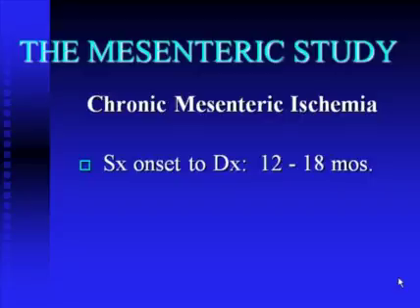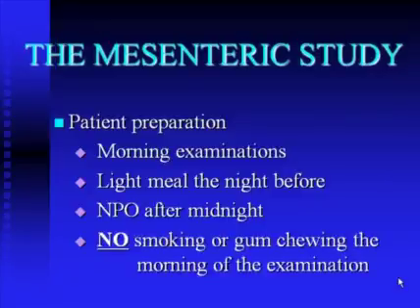I would hope through this talk to encourage the awareness of the hemodynamic factors involved with this and urge an early duplex ultrasound examination in patients with this symptom complex, because it's a very easy half-hour examination to sort out chronic mesenteric ischemia from normals using duplex ultrasound.